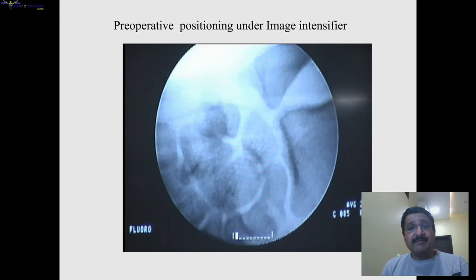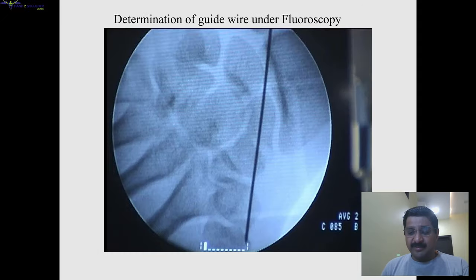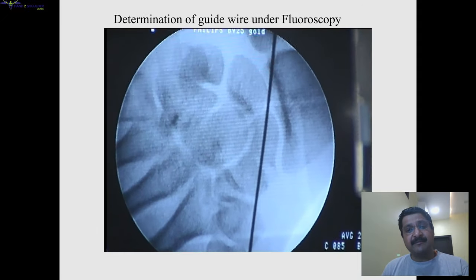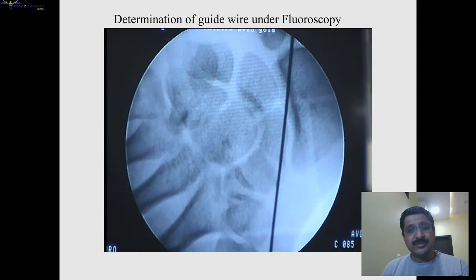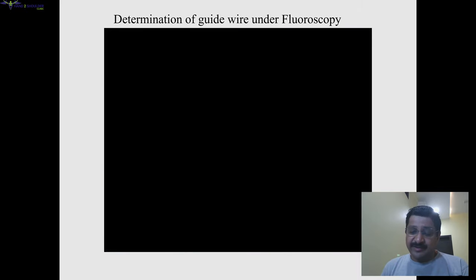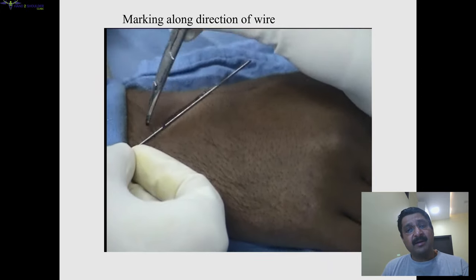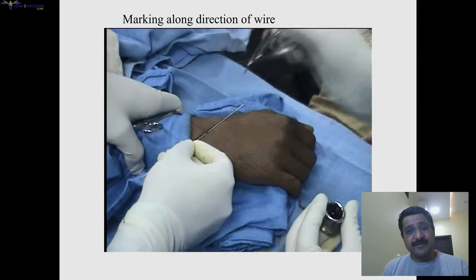Pre-operatively, we should position the wrist we are going to operate under image intensifier — positioning is important to prevent repeated exposures. We should determine the direction of the wire on the skin over the CM joint and mark it along the direction of the wire.